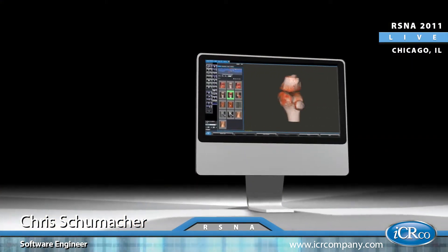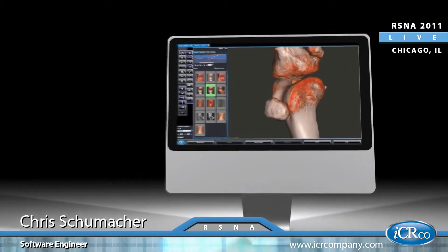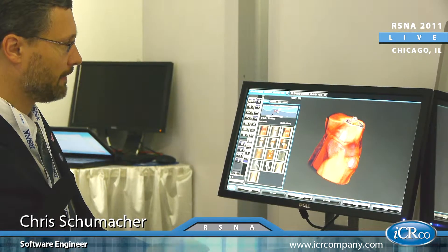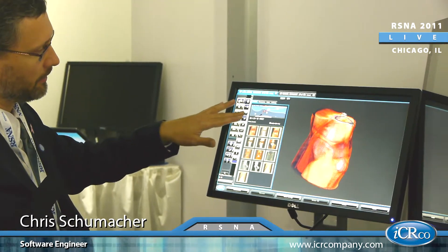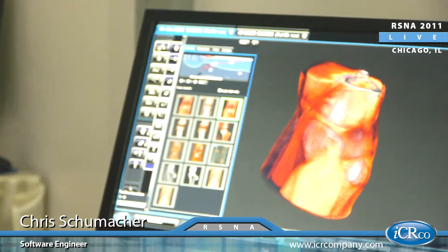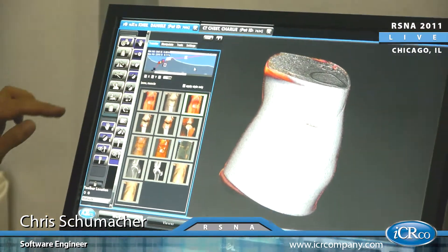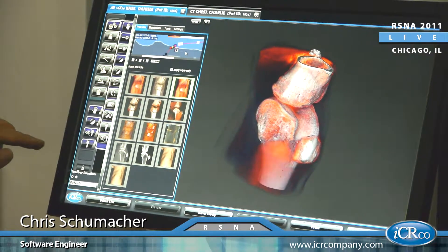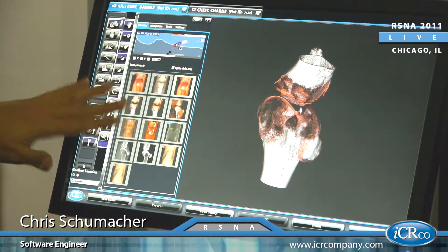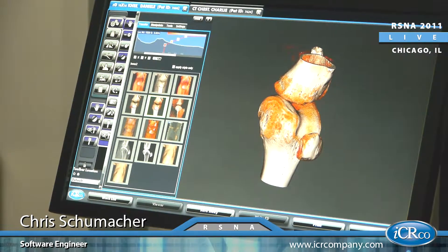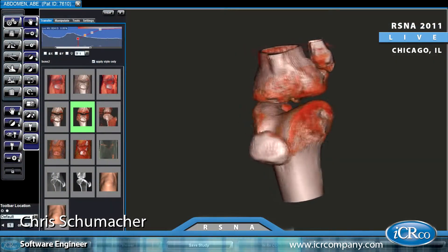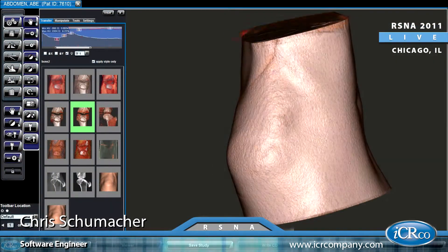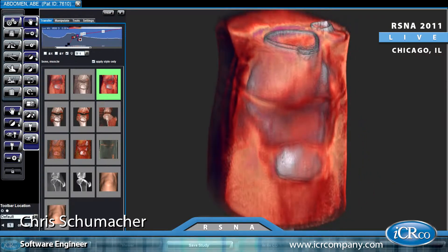We have CT data here and we have all the basic functionality of 3D volumetric rendering. We have a transfer function editor where we have softer tissues down to harder tissues, and we can move the transfer function and go from skin all the way back down to bone. We can switch to different transfer functions, and we'll have a large collection of transfer functions for different parts of the body. We're able to manipulate and cut into these.